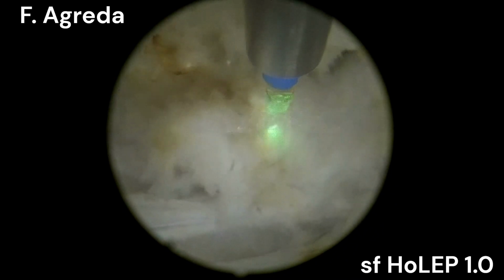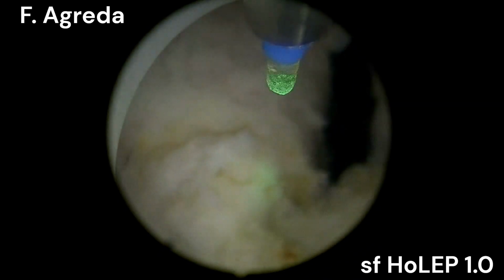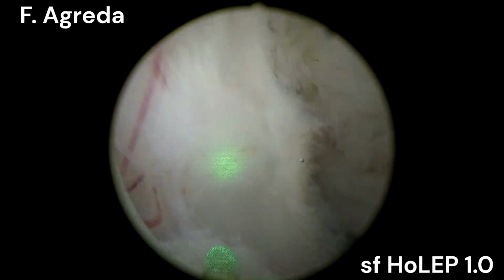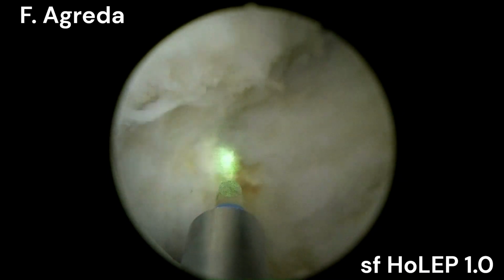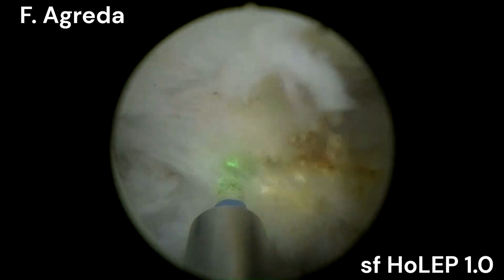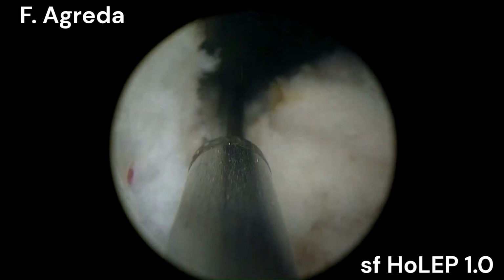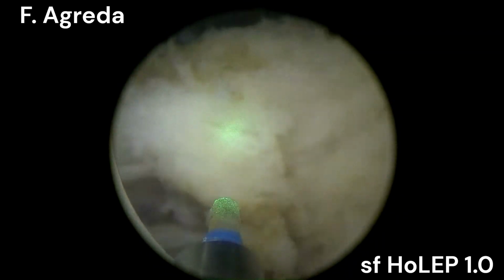When in doubt about what is supposed to be done, you have to look back like this. Take a big picture, a perspective of what you're doing, and go back to what is supposed to be done. When you're very close to the tissue, sometimes you can't see the complete perspective. Now the adenoma is completely free, so you can see here it's a whole piece. There's this rest of adenoma here.